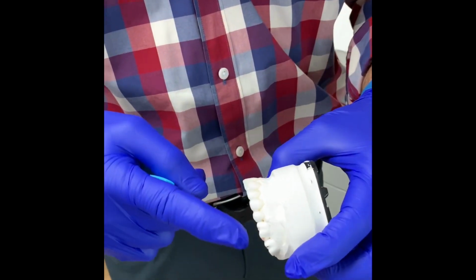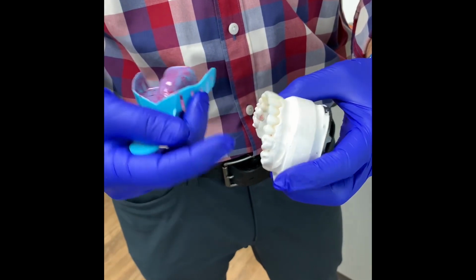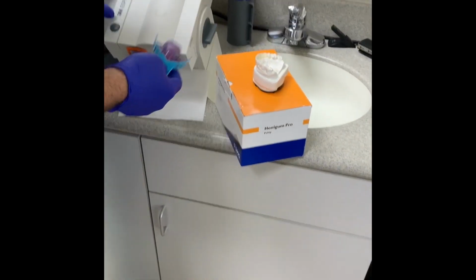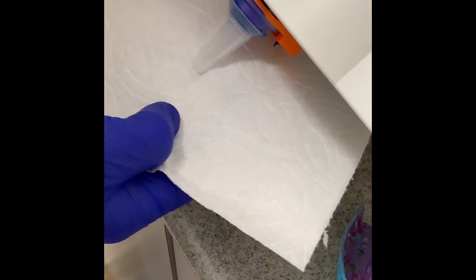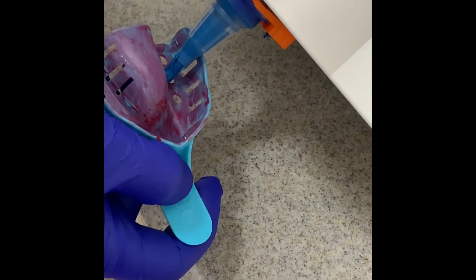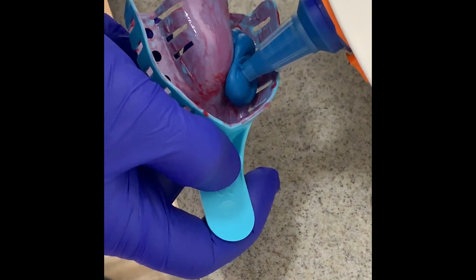All right, so we've painted our wax up with Vaseline, which I really like to do because I find that it makes the material separate a lot easier. And we've painted our tray with a VPS adhesive. Now we're going to fill our tray with the putty. One thing I always like to do is express a little bit first, just to make sure that my mix is consistent. Once we've confirmed that it's consistent and coming out in an appropriate color, we'll fill our tray with the putty.